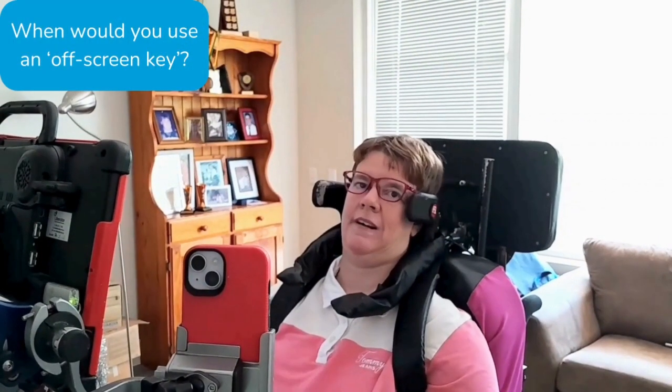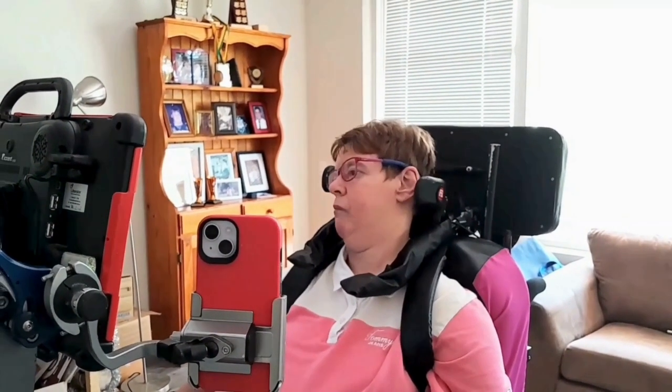I use the off-screen keys for storing notebooks because I can't fit every notebook on my home page.